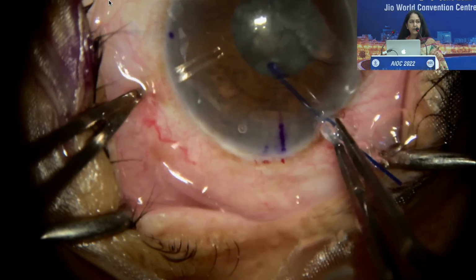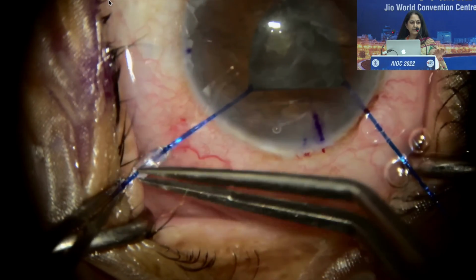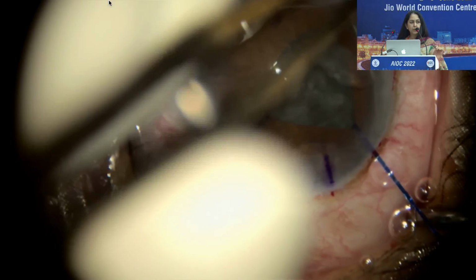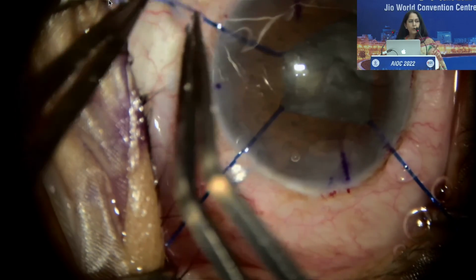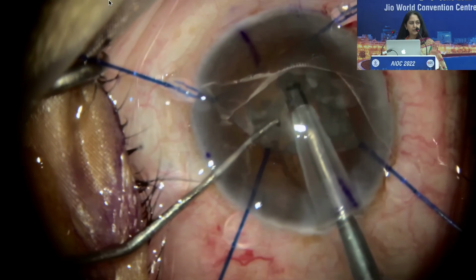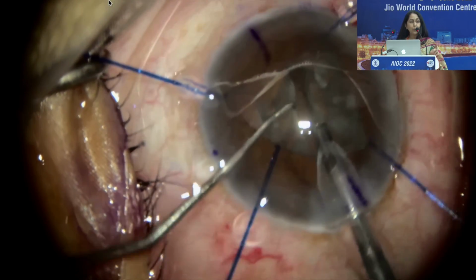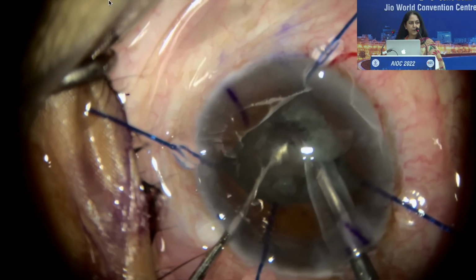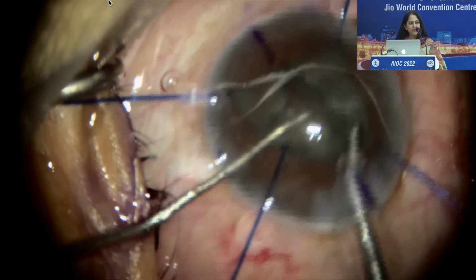Now, whenever you're putting in the hooks, the important trick is that you need to make these paracenteses very peripherally, as I'm doing here. Don't go too anterior, because if you do that, you'll cause tenting of the iris. Most people say that post-operatively, after the surgery, the pupil has not come back to its normal size. So the very important part is that you need to know when to stretch it and when to release it. At different parts of your procedure, you must release the iris hooks also. Don't just let them be where they are.